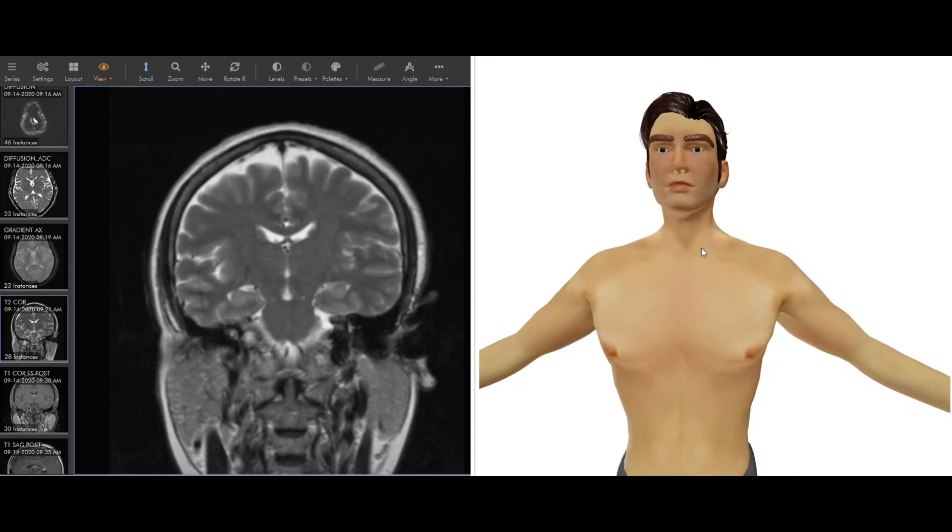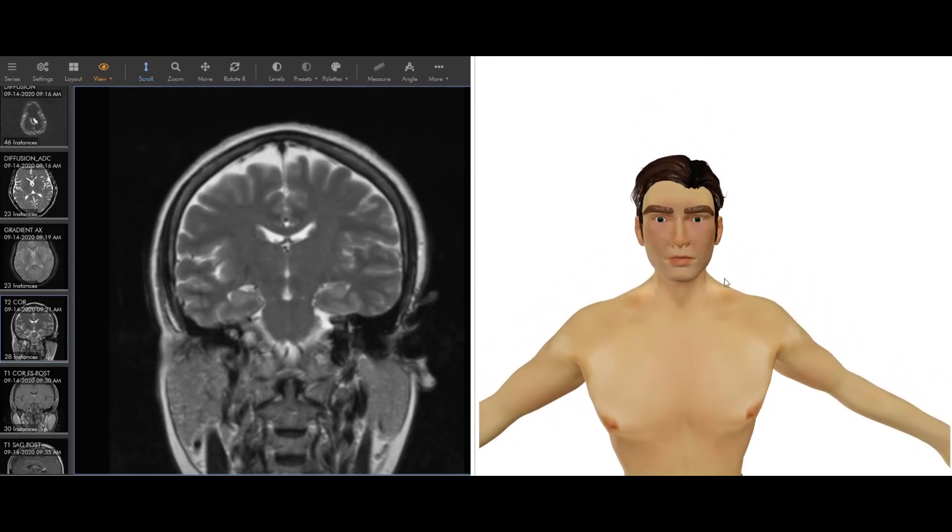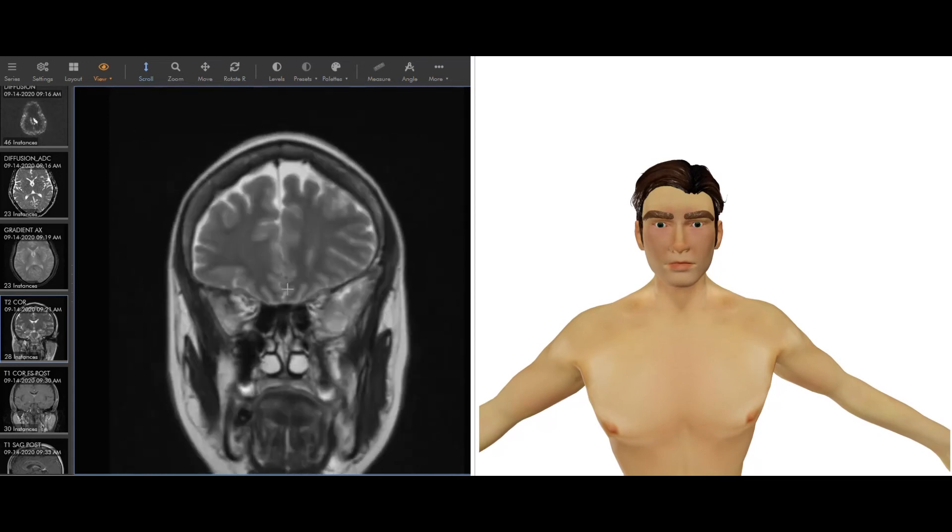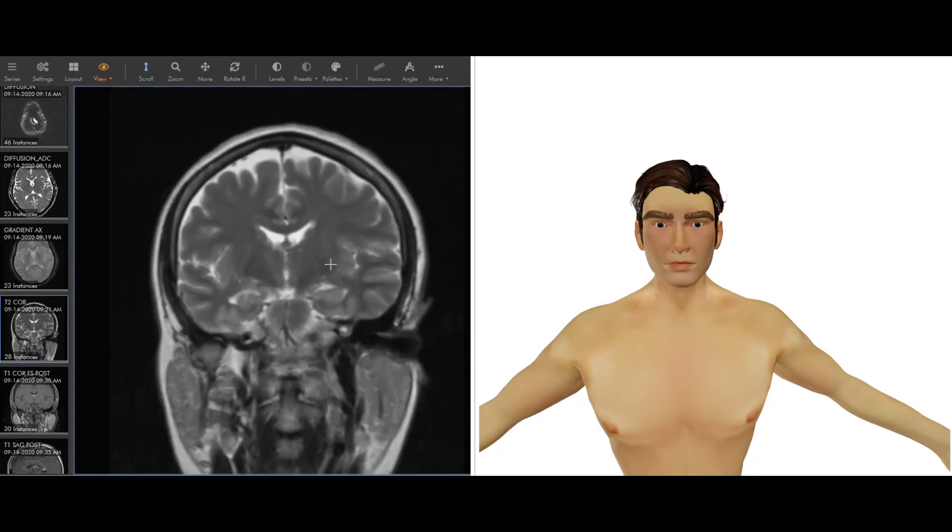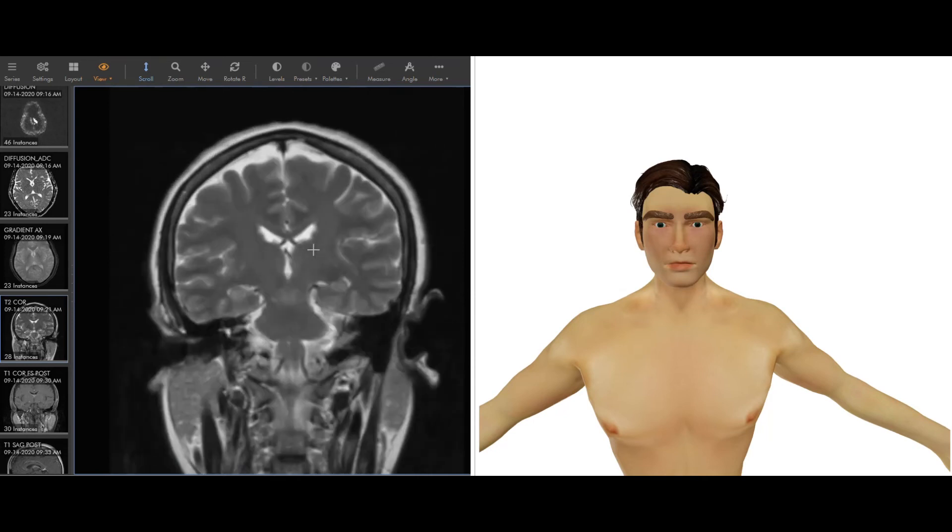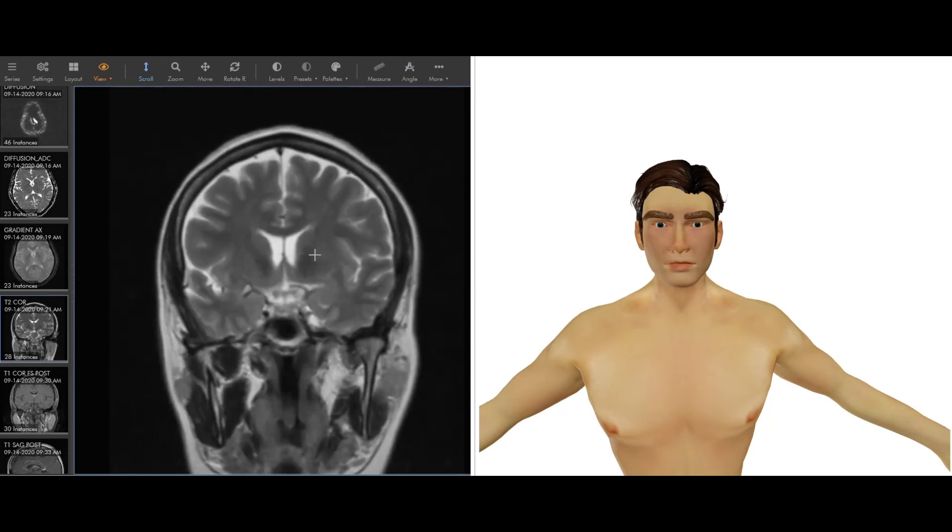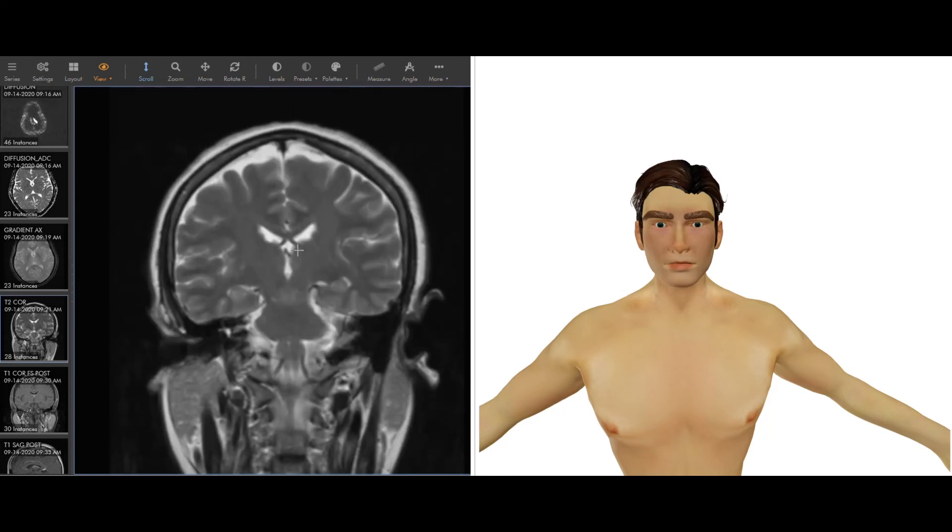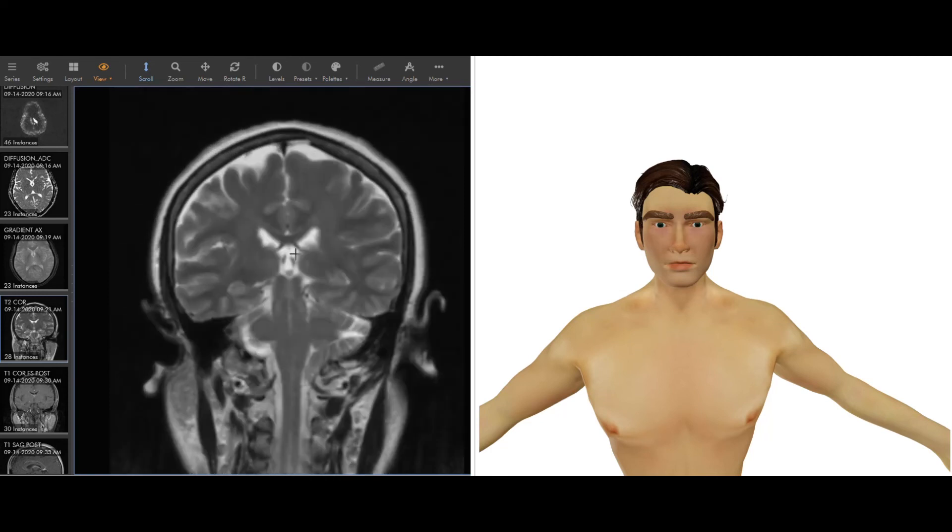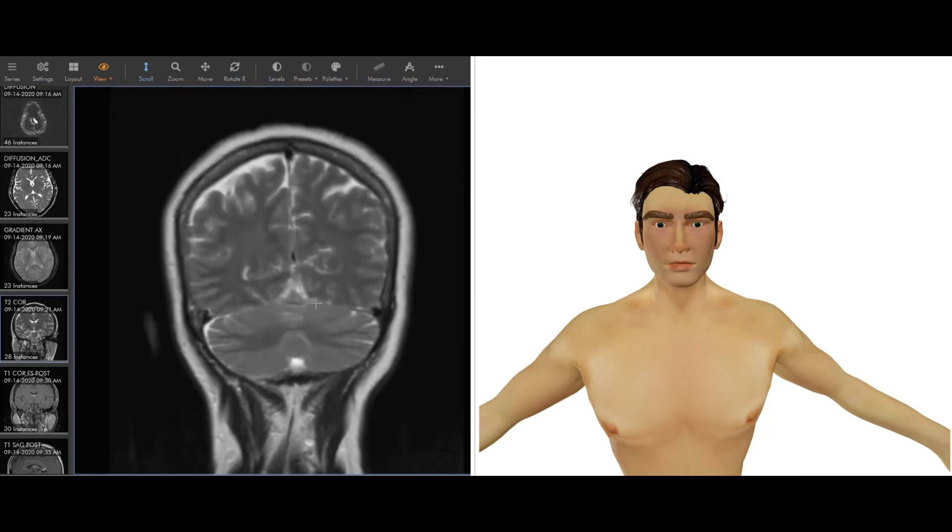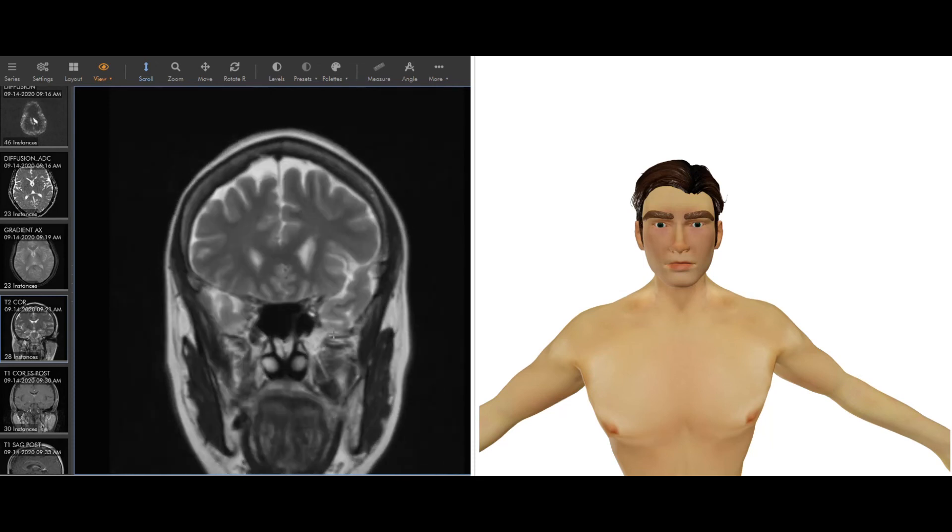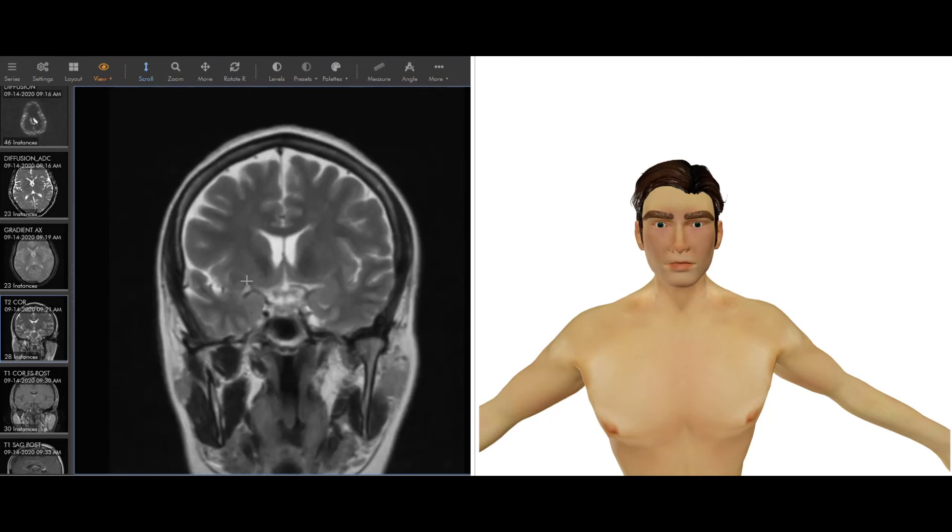We can do T2. This is from the front, this is called a coronal view or front view, so this would be looking straight on at somebody's face. And then this is the T2. So again, things with more water in them are going to be brighter. You can see fluid here is bright white, and then we have the white matter and the gray matter. So the white matter in this case is a little bit darker than the gray matter, and we have fat all the way throughout the face, like within the orbits here. This is all fat and white, so this is a non fat sat image.